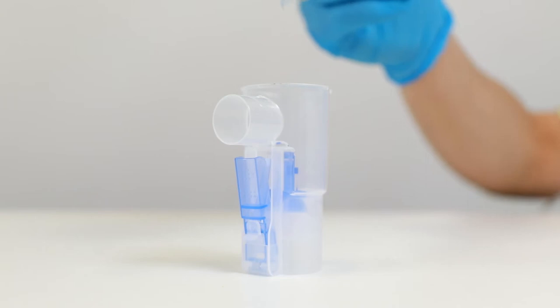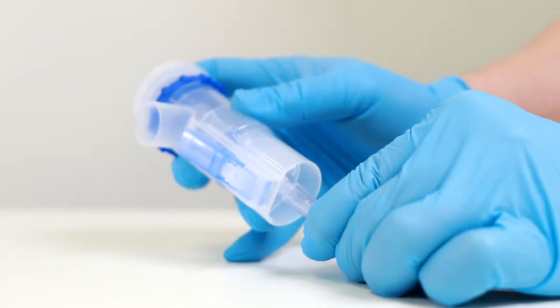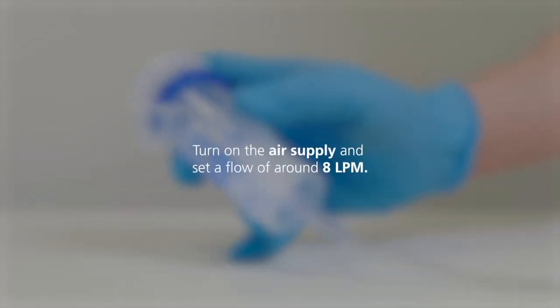Remove the cap and fill the Maxineb Duo with the required medication. Close the cap and connect the supply tubing to the bottom of the Maxineb Duo. Turn on the air supply and set a flow of around eight litres per minute.